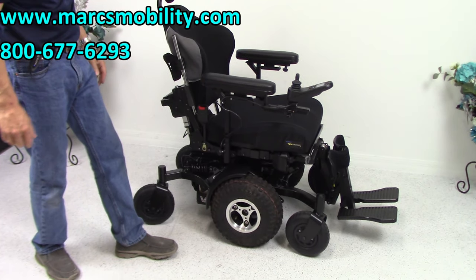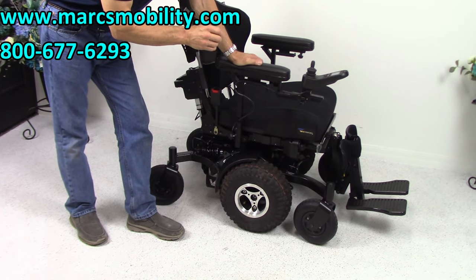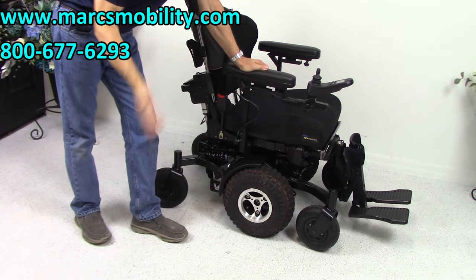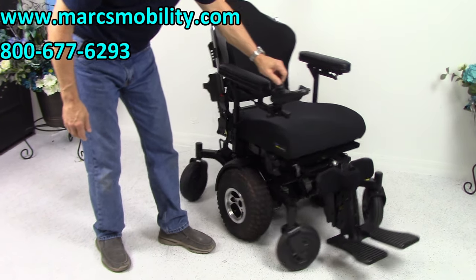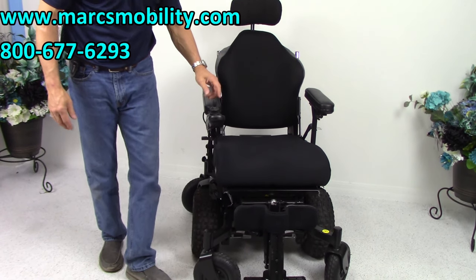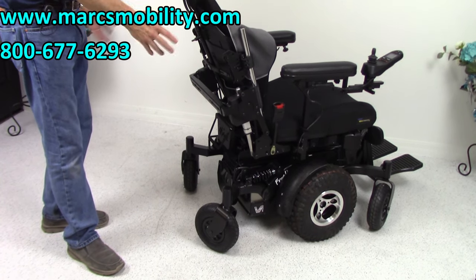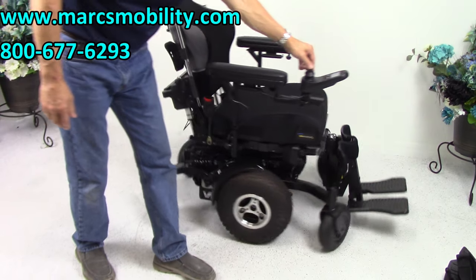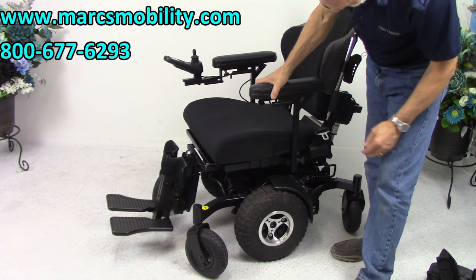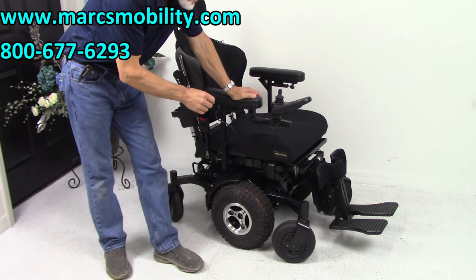So let's recap. We've got a Magic Mobility Frontier V6 Extreme Power Chair for people who want to do some extreme riding outside. It has the 12-inch seat lift, electric tilt, electric recline, electric legs, and swing-away joystick. It has a large 20 by 22 seat with a contoured back, retractable belt, flip-up arms, solid suspension and anchor points, a well-built headrest — fully loaded with only 17 miles on it and ready to go.